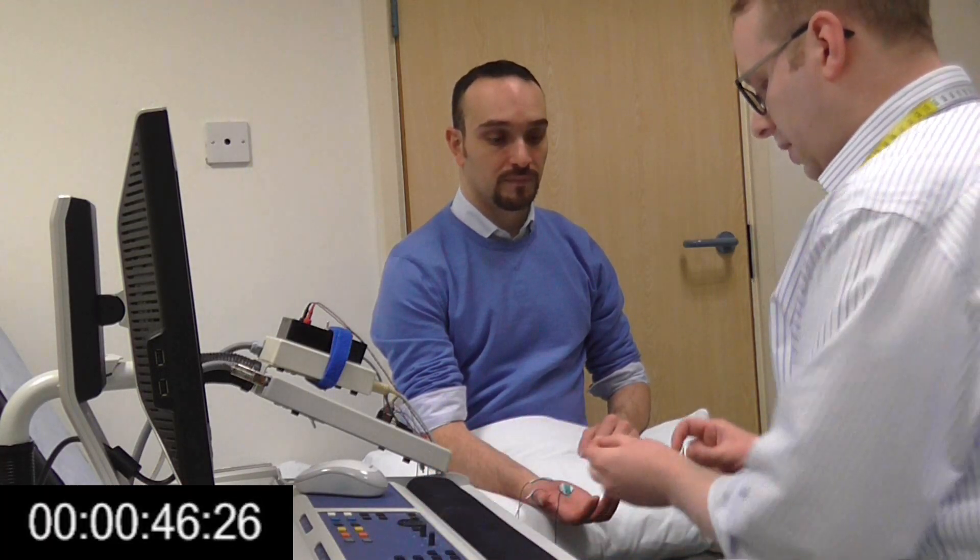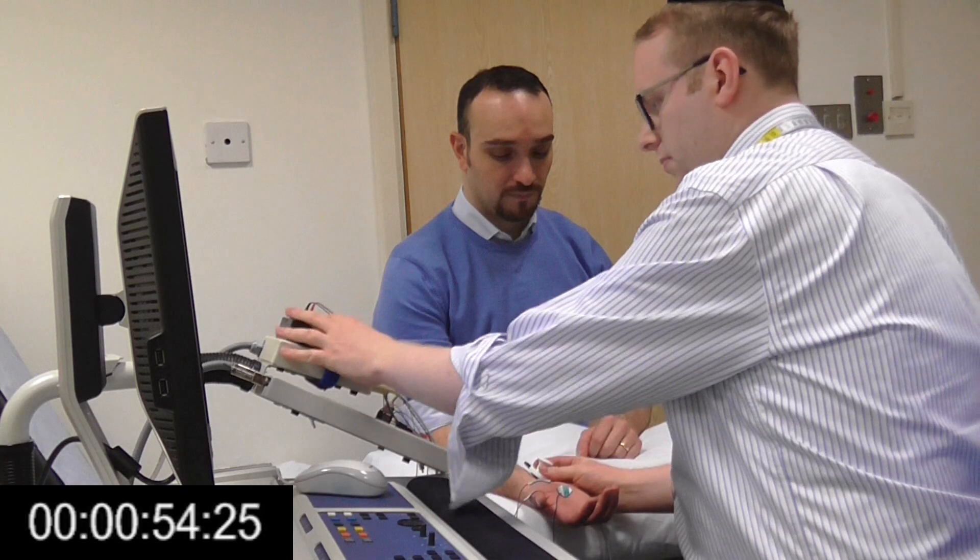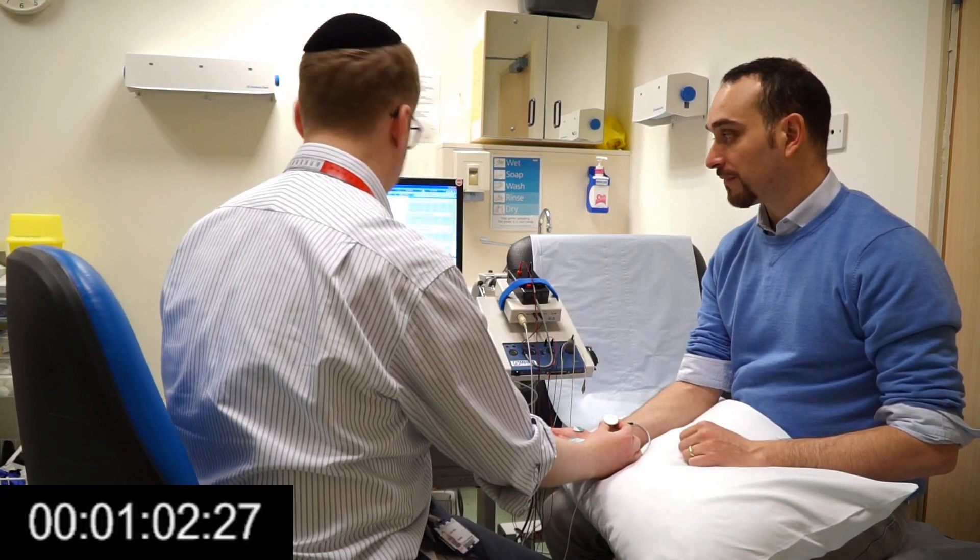What you're going to feel now is a little bit different. I'm going to be making your thumb move upwards. It might feel a little bit sharper than previously, but that's not because of a change in the current per se — it's to do with the muscle having this small little cramp. I hope that was OK. Was that all right? Fantastic.